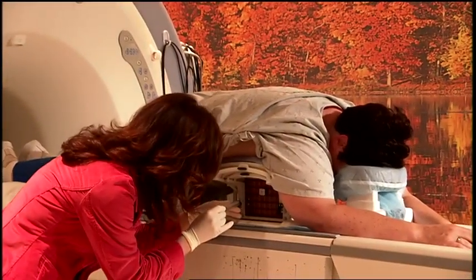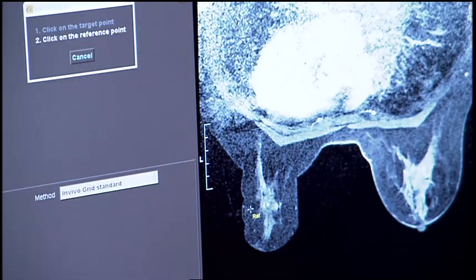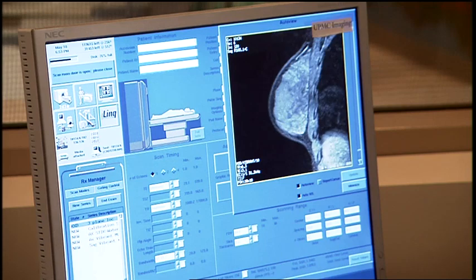The biopsy site is cleaned and an anesthetic is injected. A needle guide is used to carefully align the biopsy instruments. Another short set of MRI images is taken to confirm the position of the instruments.